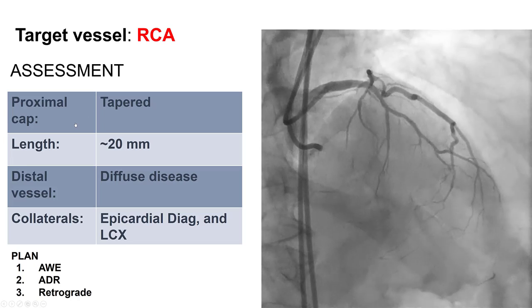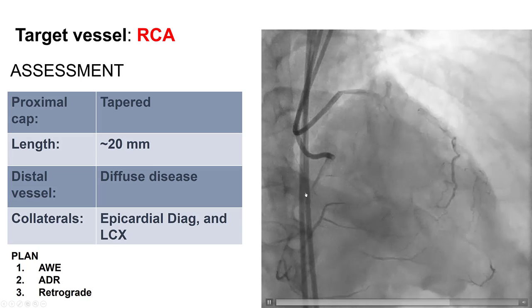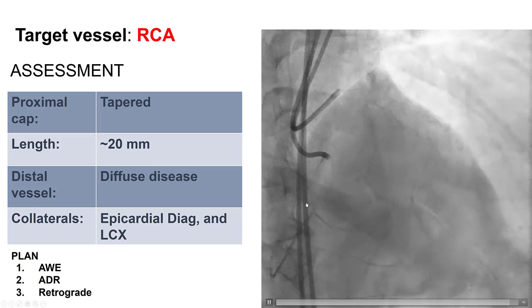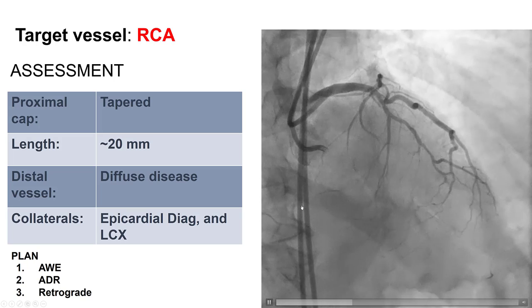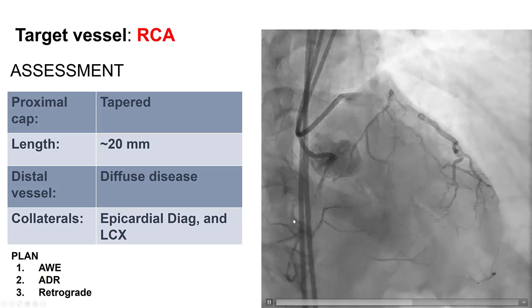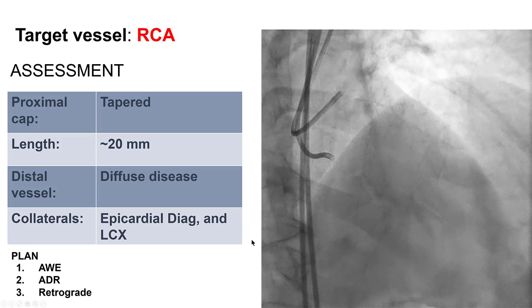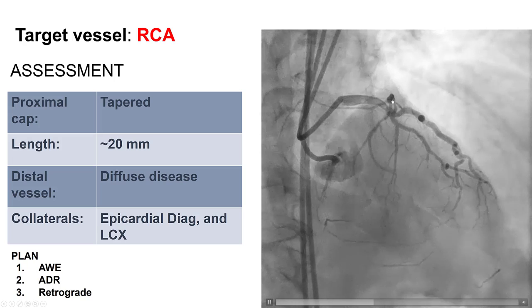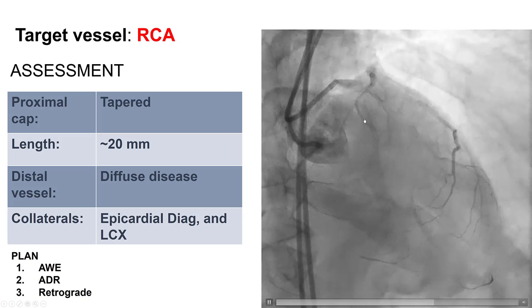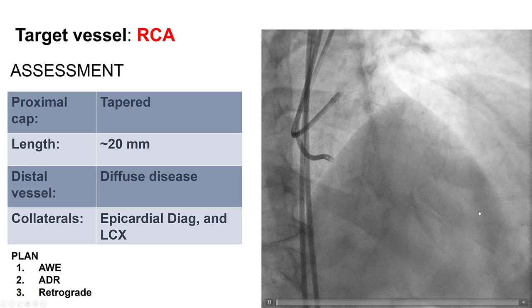This is the dual injection. We do have a CTO of the RCA with a well-defined proximal cap, although there is a small branch next to the proximal cap. The length appears to be relatively short, about 20 millimeters. The distal vessel has some diffuse disease, and the posterolateral appears to be filling via some epicardial collaterals coming from the circumflex. There also may be some septal collaterals filling it.